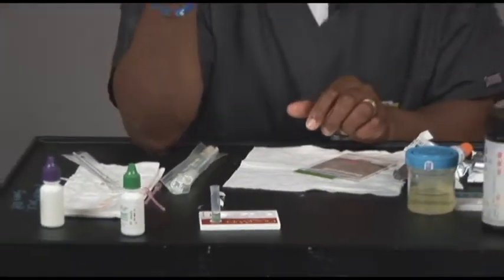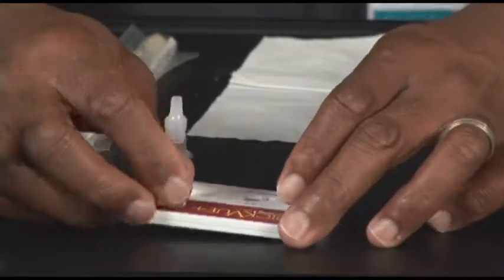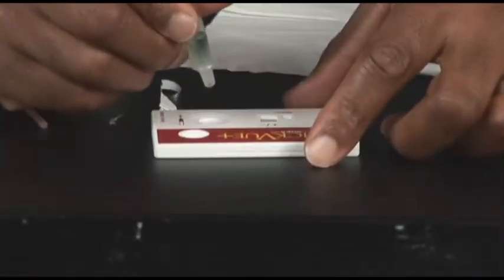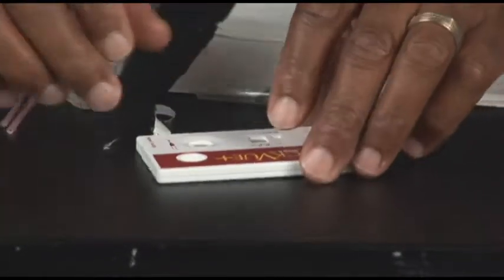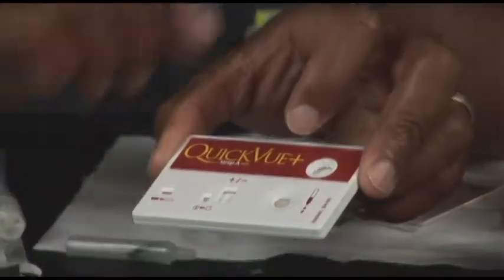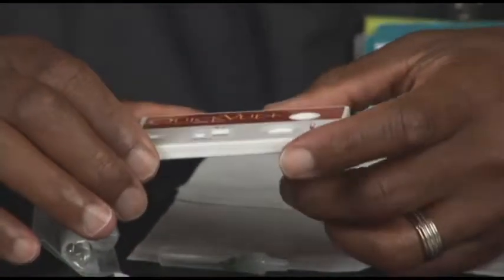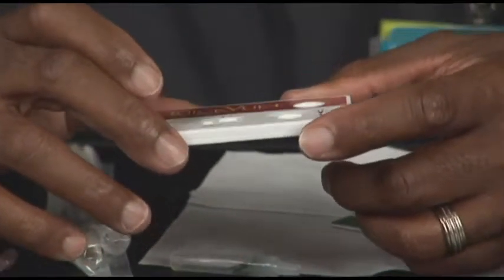Then you would use the dropper top. It goes on there. And from there, you're going to place 2 drops in the round window here. 1, 2. And again, this reads similar to the urine pregnancy test, a plus minus. Pink line down the center is positive. A straight blue line is negative. With the control box, your control line is going to be pink.